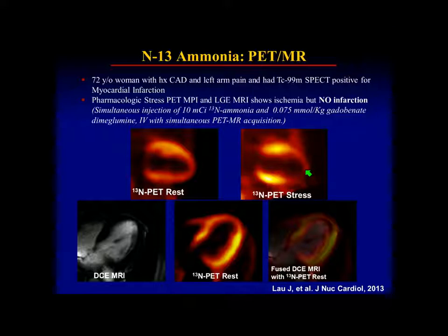I can't think of the word, I always forget this word, but it's like a cushion. We actually have springs in there that provide resistance to that, so the plastic cases don't break. Anyway, what you're seeing here is a patient. It was a questionable stress rest, maybe technetium study, and a larger person.